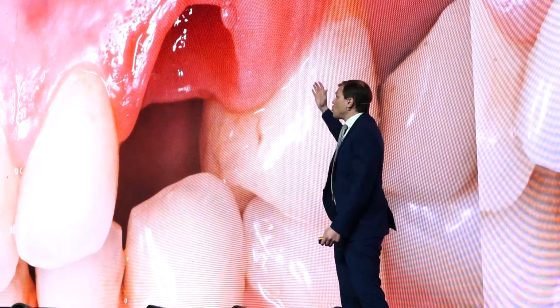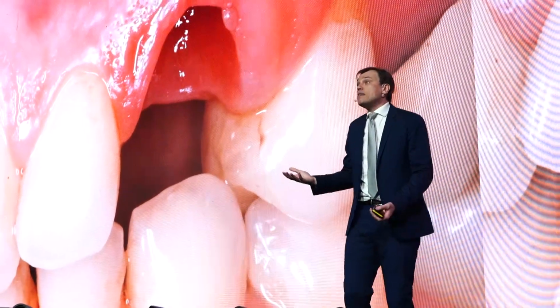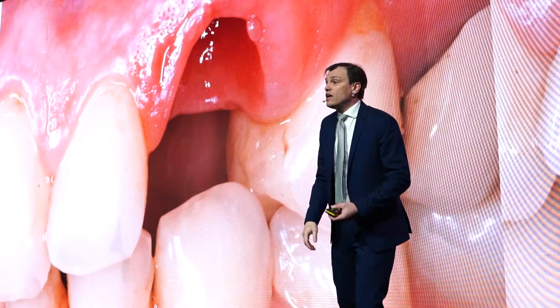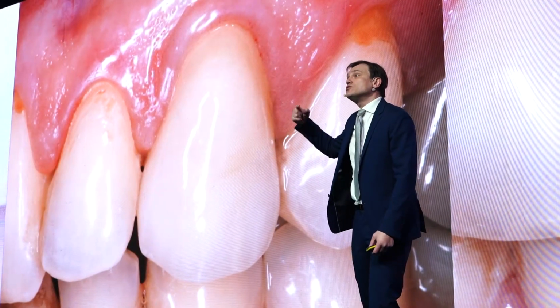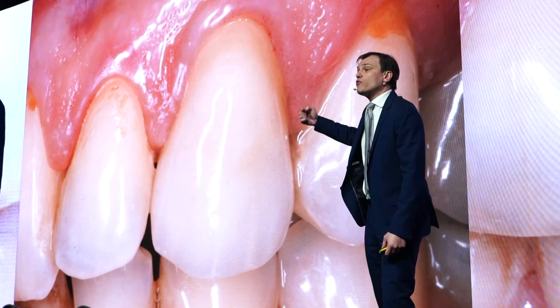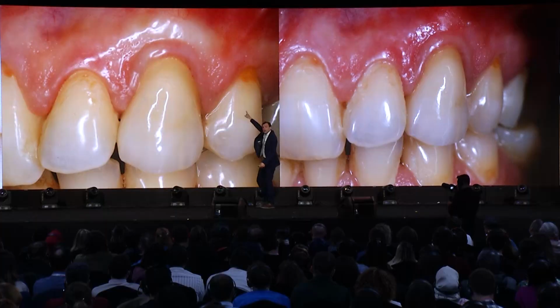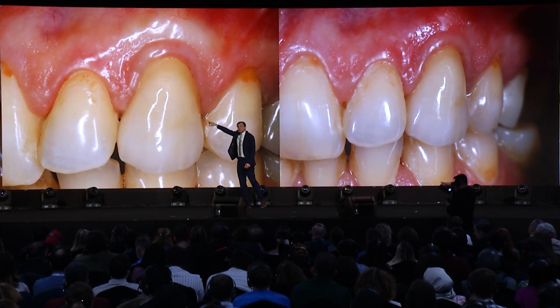We have the contour which was maintained by immediate implant placement, deliver the restoration, and you see soft tissue improvement with time. You see that this rim above the tissues, above the crown, it's getting thicker.